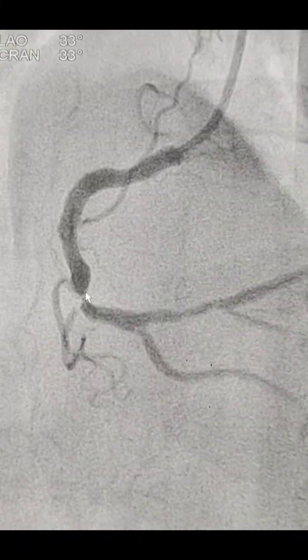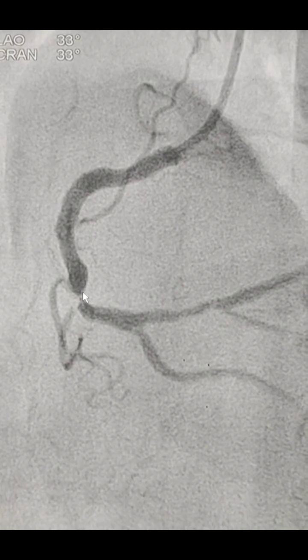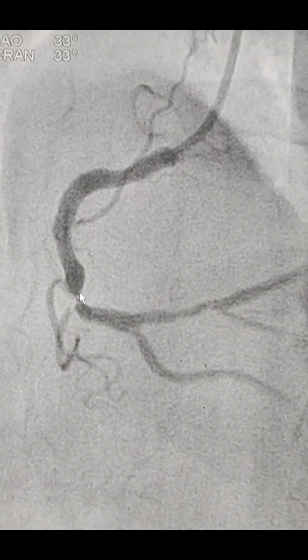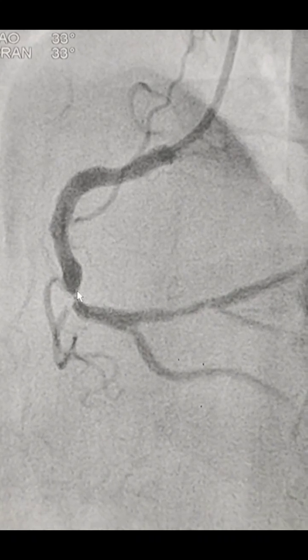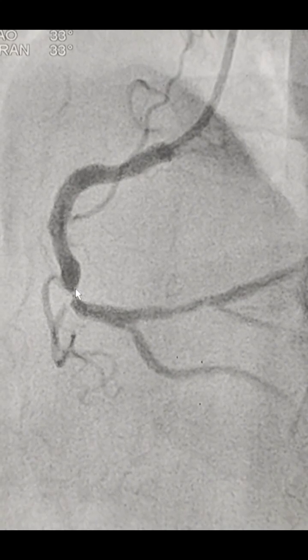You can notice just above the arrow, there is some sort of aneurysm, or it may be a bend, or some thrombus maybe. So we need to be very careful while putting the wire and while doing stent angioplasty. The aneurysm may get damaged and may perforate. So I wanted to put a distal stent first in the PLVB, but see what happens.